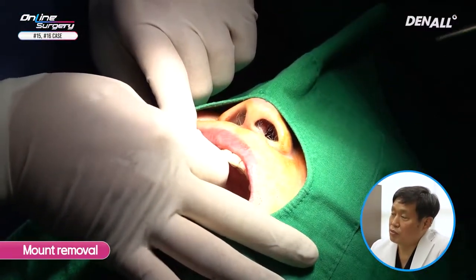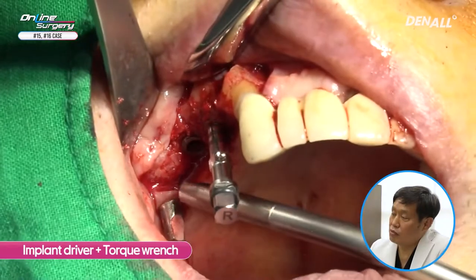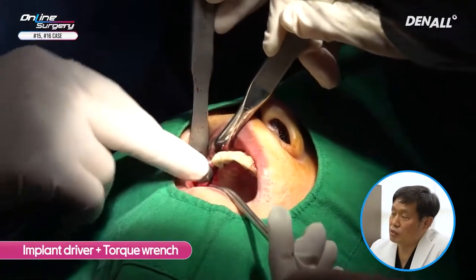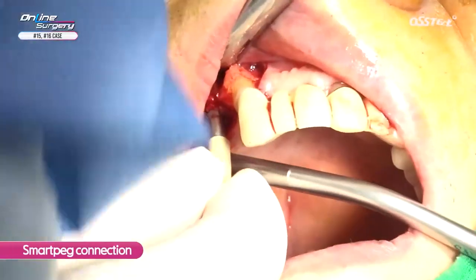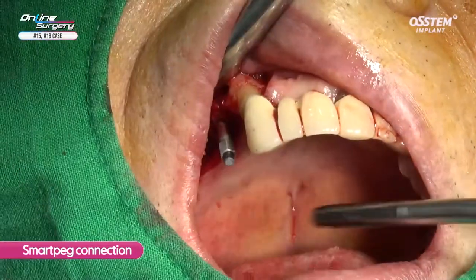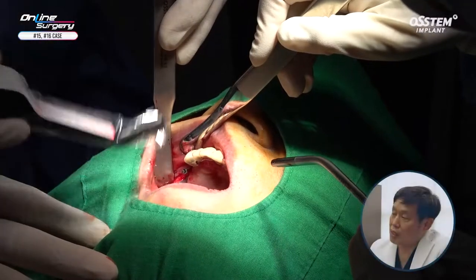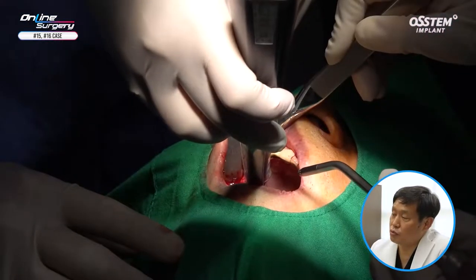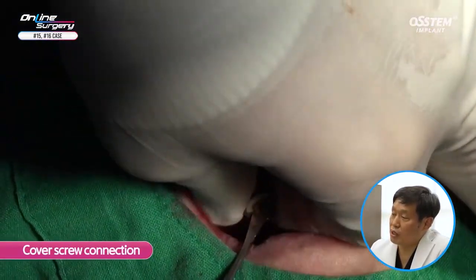An open wrench is used to hold the mount because primary stability is concerning, especially for number 16. You make sure the implant does not move. The pre-mount is removed. An implant driver is used to get the final position. In number 15, there's quite a lot of alveolar bone, so I try to place it deep. The ISQ value is taken. In the case of number 16, primary stability is lagging — it's 46. In the case of number 15, it's 71.